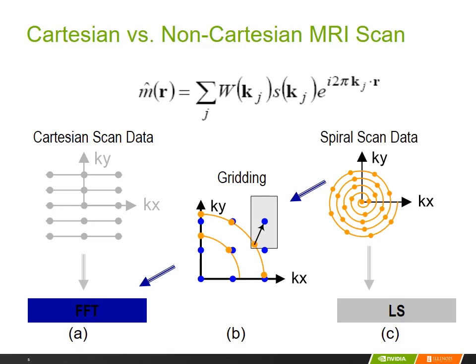While the traditional MRI approach based on uniform samples in the Cartesian space is computationally efficient, it actually has quite a bit of deficiencies for medical applications. The most important deficiency is that it oftentimes does not provide enough resolution or fidelity in the areas that matter. So that's why there have been a lot of proposals for much more sophisticated scanning patterns or data sampling patterns to improve the quality and outcome of the reconstructed image.